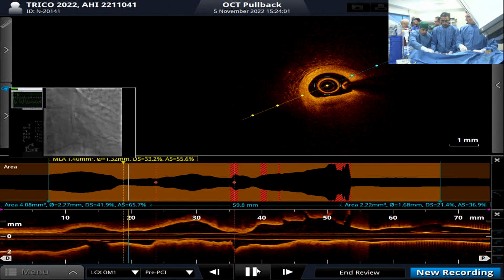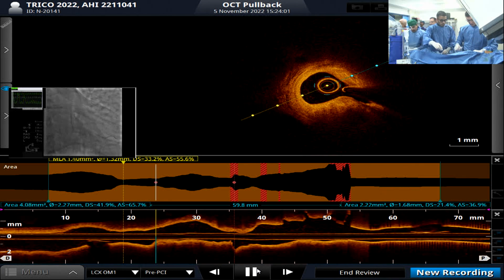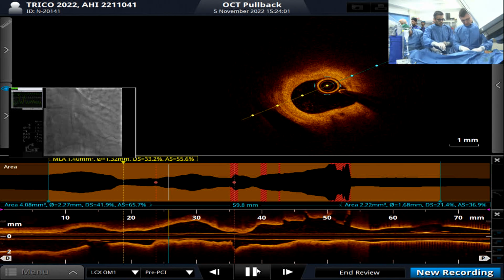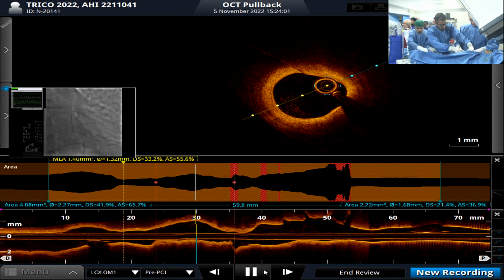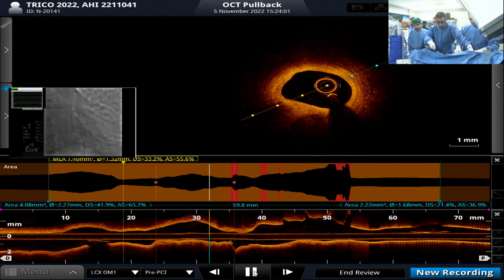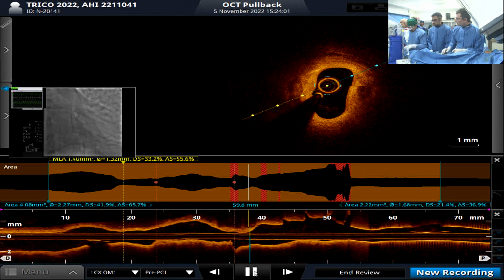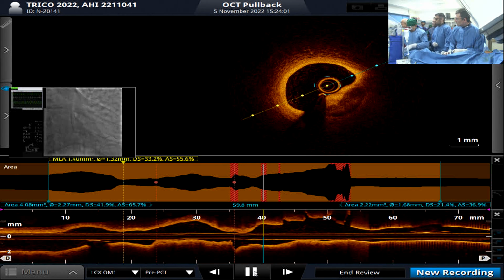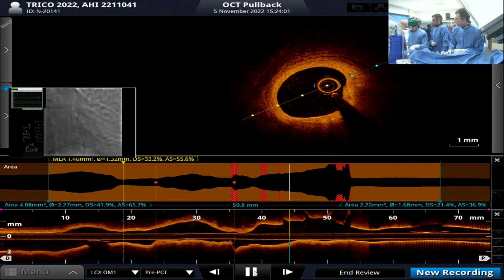Dr. Akasaka, please give your comments. Here is the stenotic part, right? Some lipid, some calcium, and healed plaque in some regions. Perfect. Very diffuse disease, right? And here is a branch. Yes, there is calcium. And the size is 3.0? Some calcium, right?